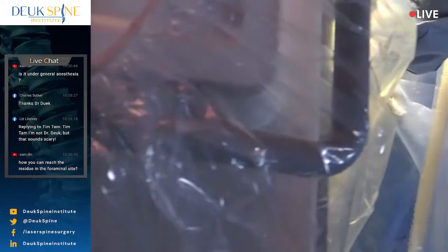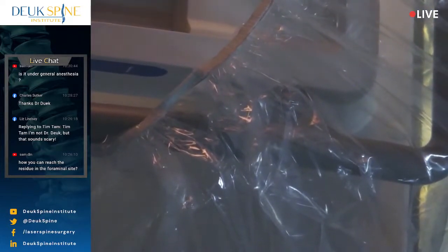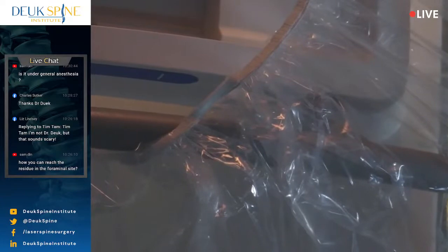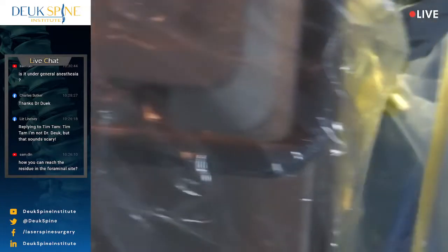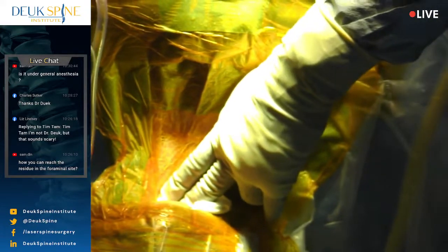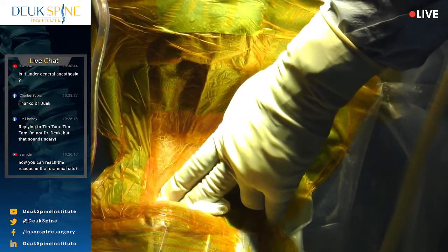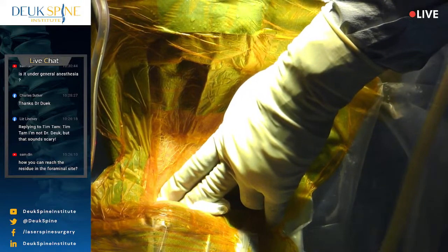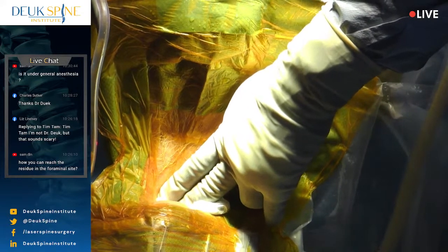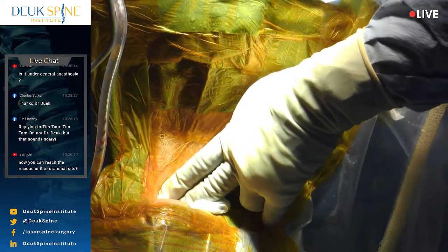It's amazing. You see we've lost about a drop of blood, maybe two, you could argue. But far less than a CC. Come on in. We never do AP. It's always lateral. So folks, we're going to go to C6-7. Everyone agree? C6-7? We may need a shoulder pull, and I'll need some inline traction from the anesthesiologist. Doctor, if you don't mind, I don't need it this second. I'll tell you when I need it. It'll be in about 3 or 4 minutes. In the meantime, I'm just holding pressure because of the blood. Irrigation's on.